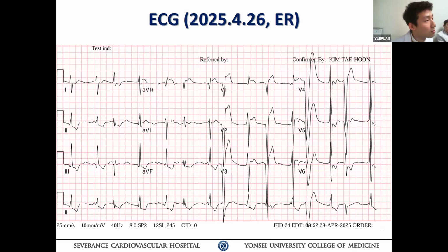For patients who have an intermittent AV conduction block, this could happen, and the beat that seems to break the rhythm looks a bit broader, which could be a fusion between something coming from above and a PVC. Yes, I'm thinking that could account for the change in the morphology.